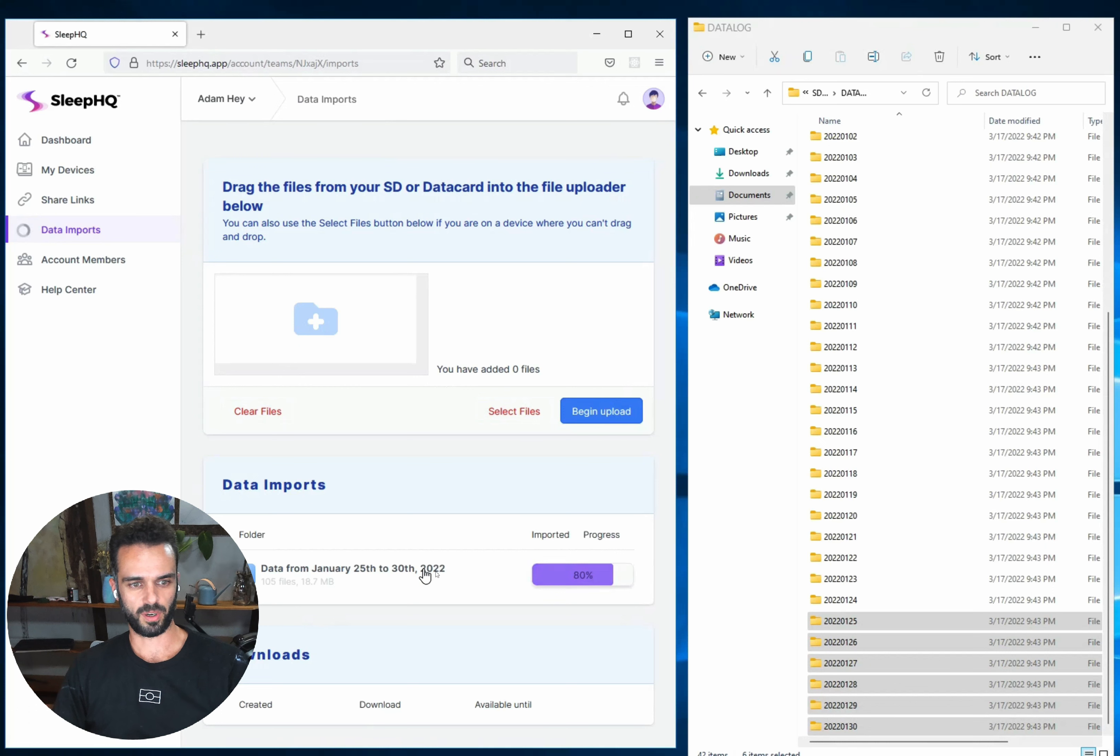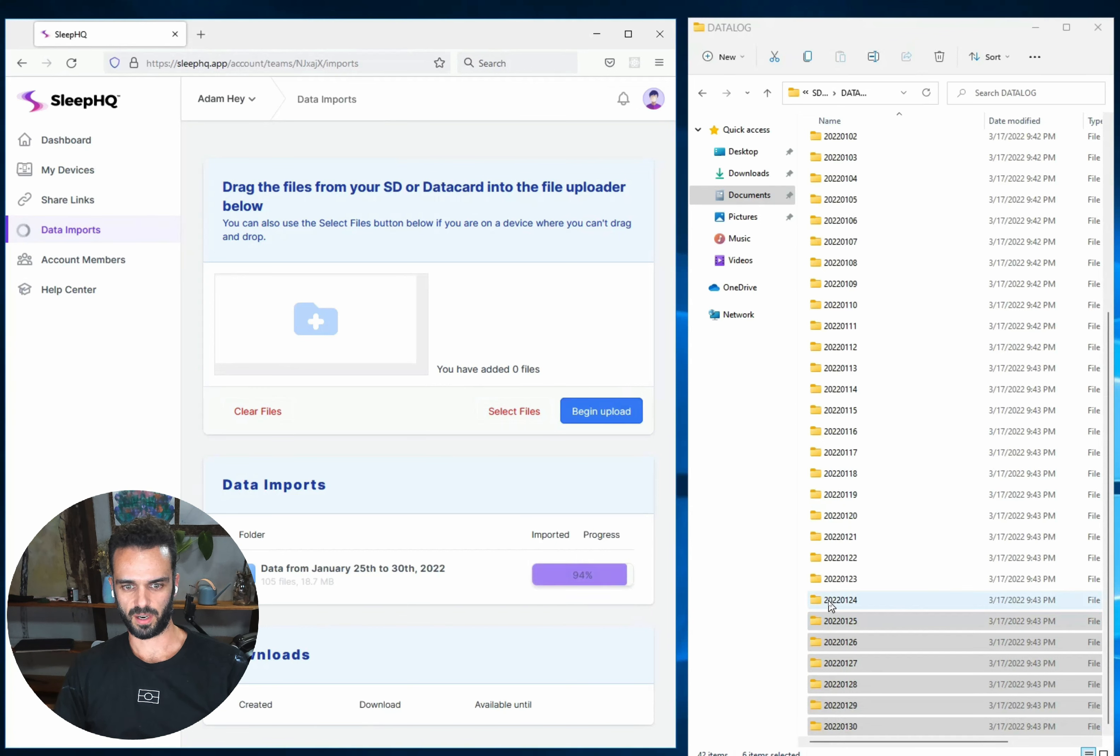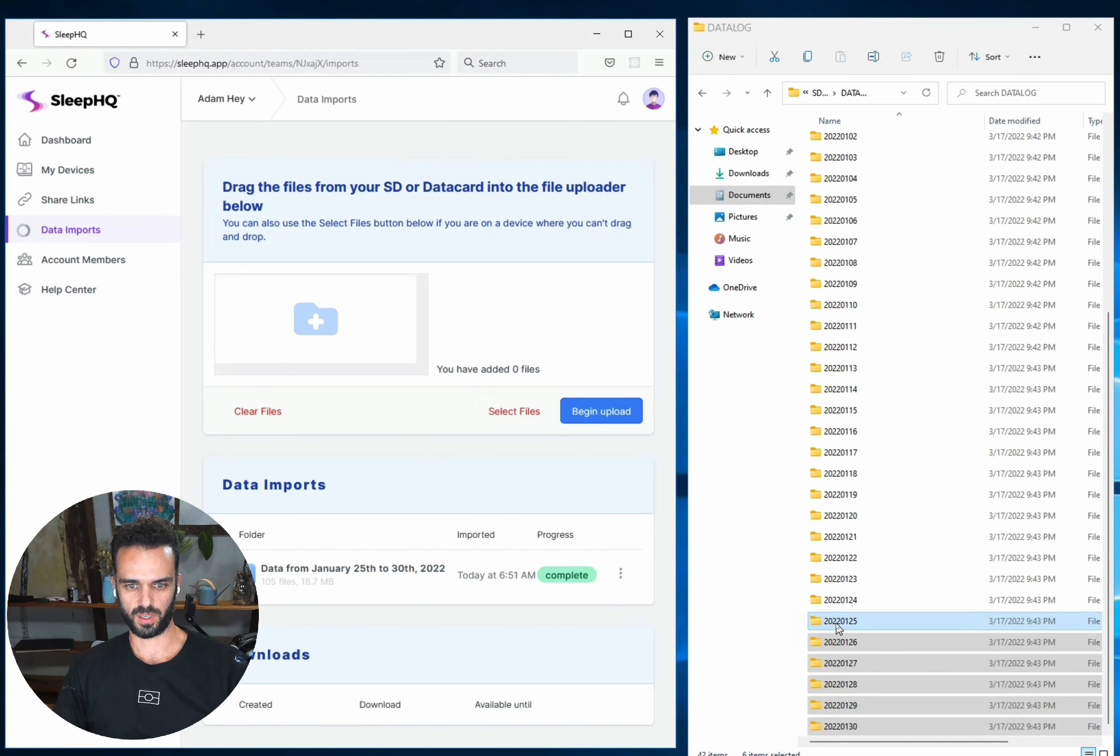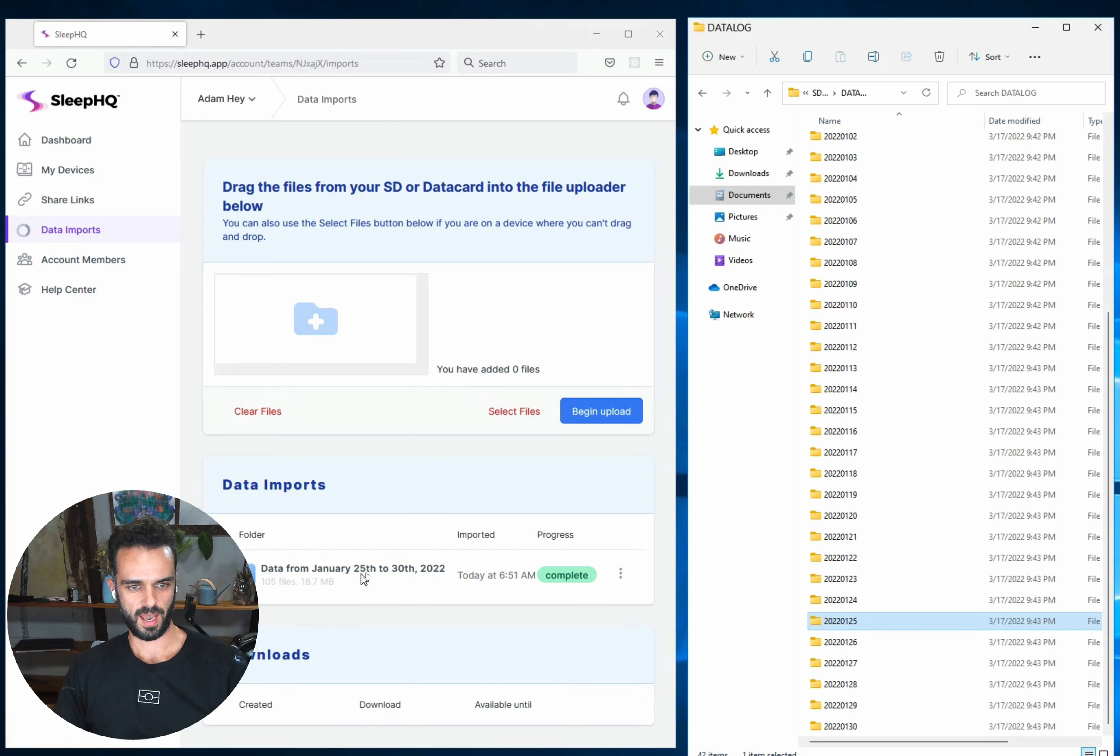So that upload is now processing and it's telling me that I'm processing data from the 25th to the 30th of January. You can see down here in my Datalog folder, all of these numbers are dates. So this one's saying 2022, 01, 25. So this folder here is the data from the 25th of January, 2022, and that one's already been imported.